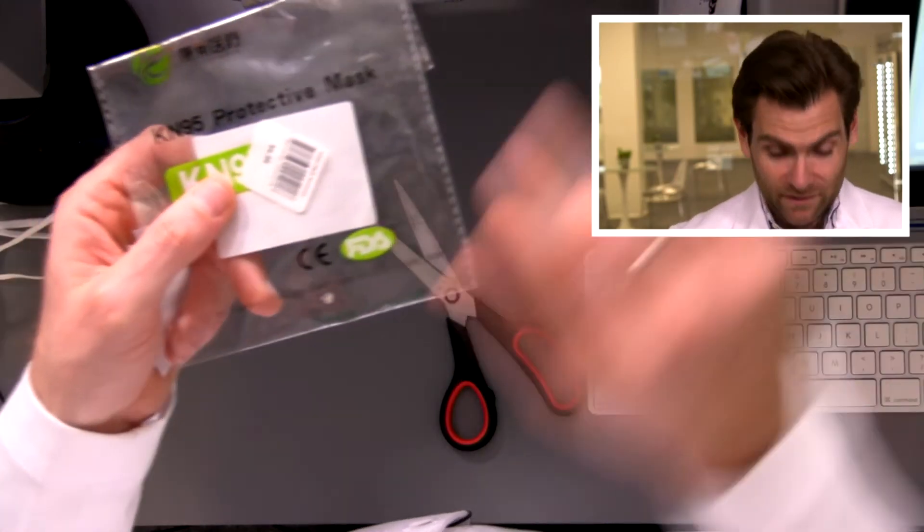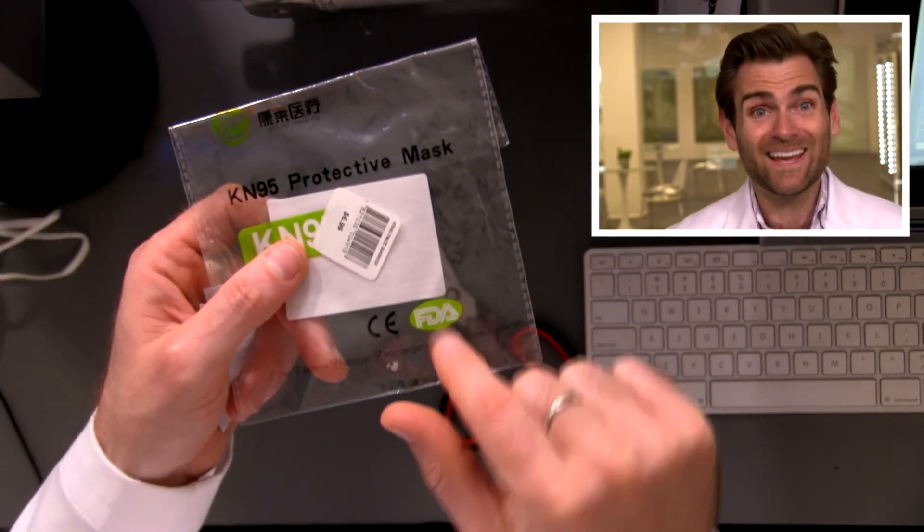Every time that you find a mask that has the old FDA logo on it, every time it will be a fake. Because you're failing twice — you don't know you're not supposed to put the FDA's logo, and you're using the wrong logo. I'm just glad that holds true. That is a nice shortcut: you see the old FDA logo on something, that's a fake mask.